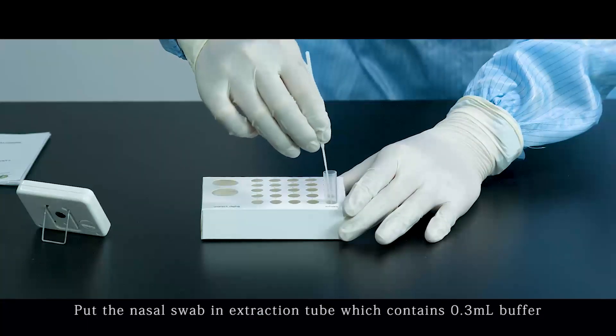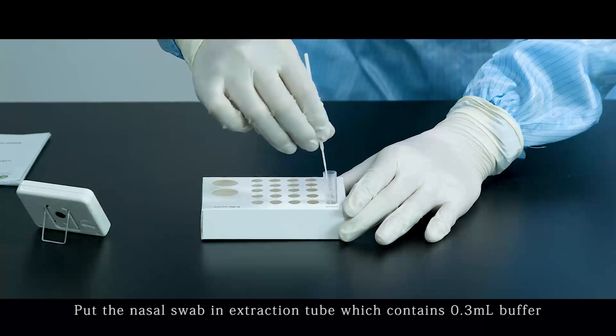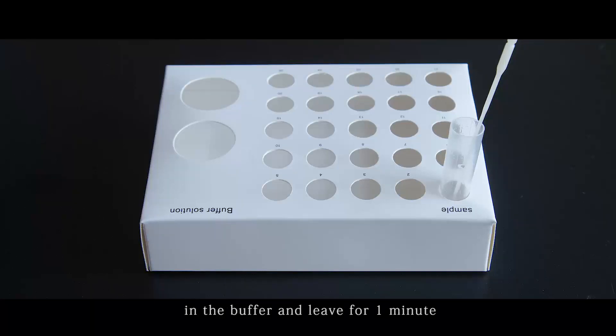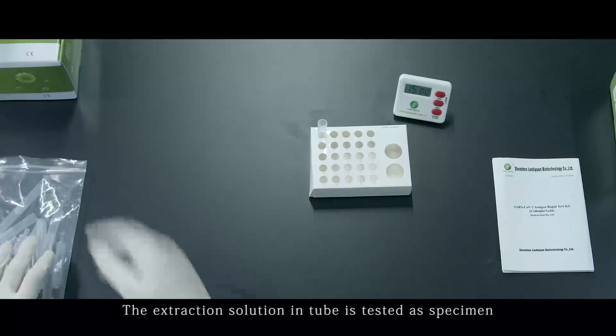Put the nasal swab into the extraction tube which contains 0.3 mL buffer. Swirl the swab not less than 6 times in the buffer and leave for 1 minute. Remove the swab. The extraction solution in the tube is used as the specimen.